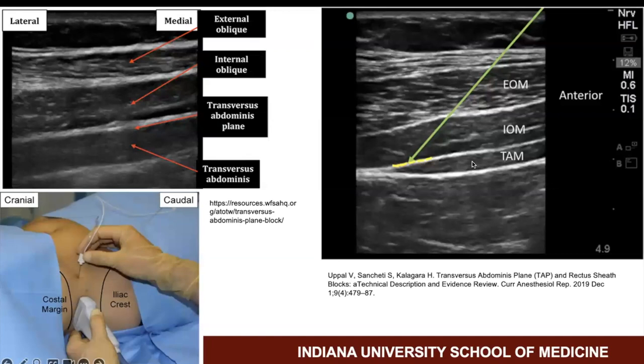Continue to advance laterally until the transversus abdominis muscle can be seen tapering off. This yellow line right here is the site of where our anesthetic will be injected. A short bevel block needle should be used.